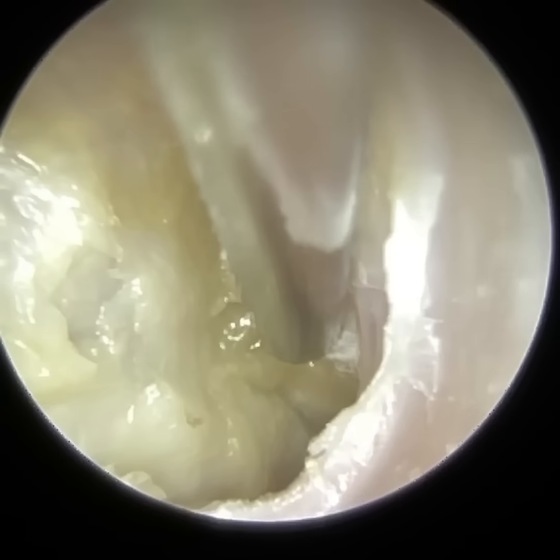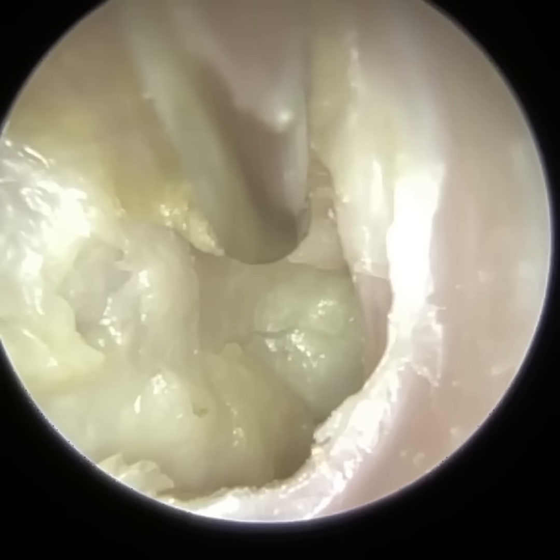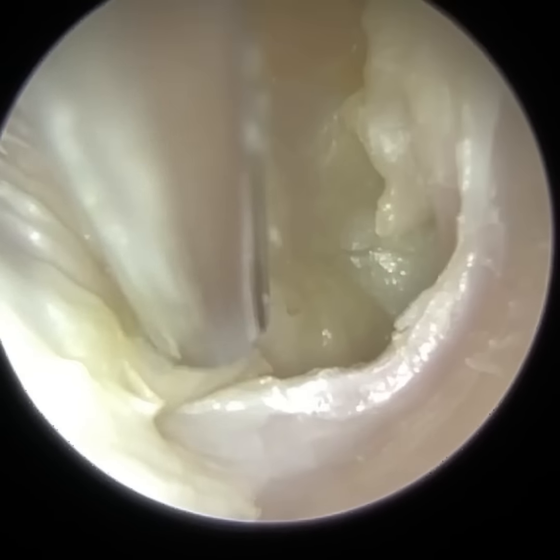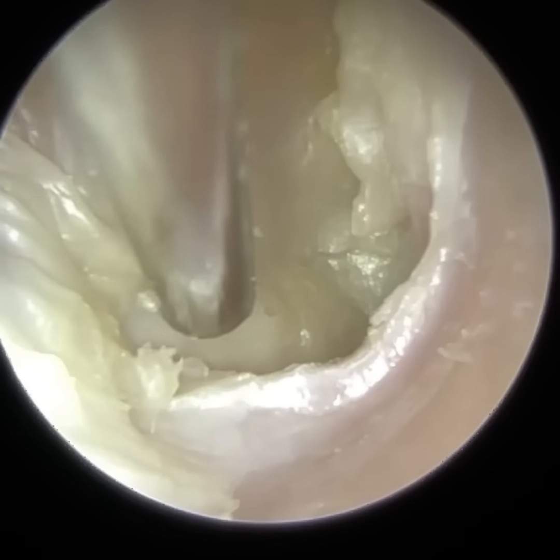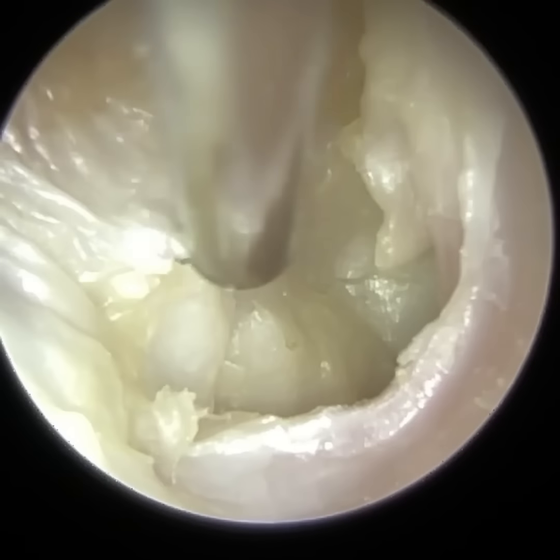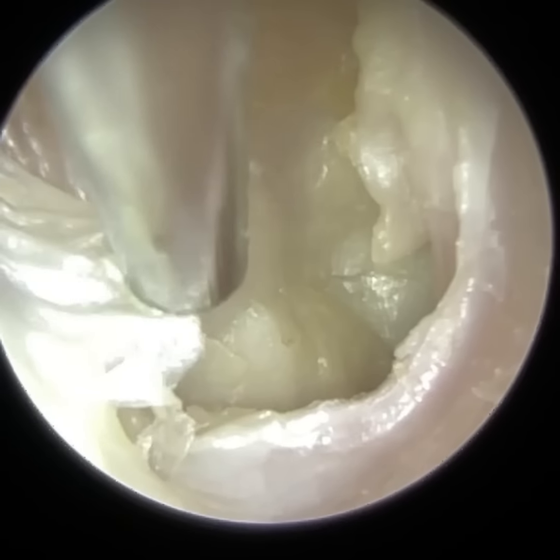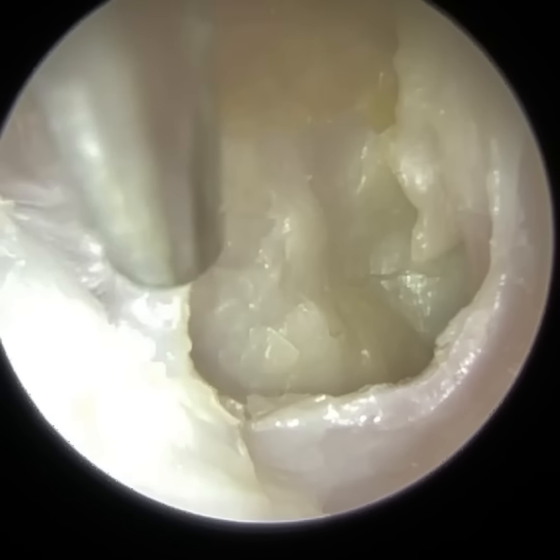We can see we're going very deep in the ear. I need to avoid the bone just to the right. You can see I'm sub-millimeter with the suction tip in terms of its proximity to the canal wall, as if you make contact with that, it will be really, really uncomfortable. A bit later on in the procedure, I'm going to angle the fine end suction tip that you can see on screen, so it just helps me to gain access into that anterior recess.